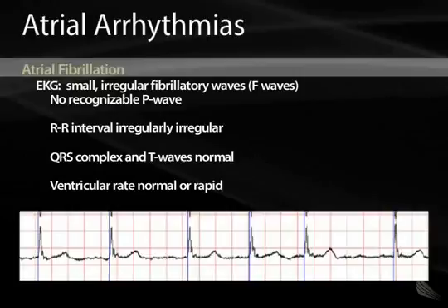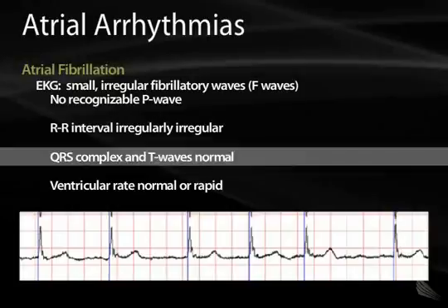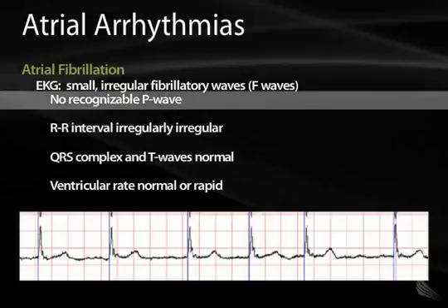Here's an example of atrial fibrillation. What gives this away is that the QRS complexes are so irregular. They don't form a normal pattern. You also don't see P waves in this strip, and you see sort of a jagged pattern to the baseline.